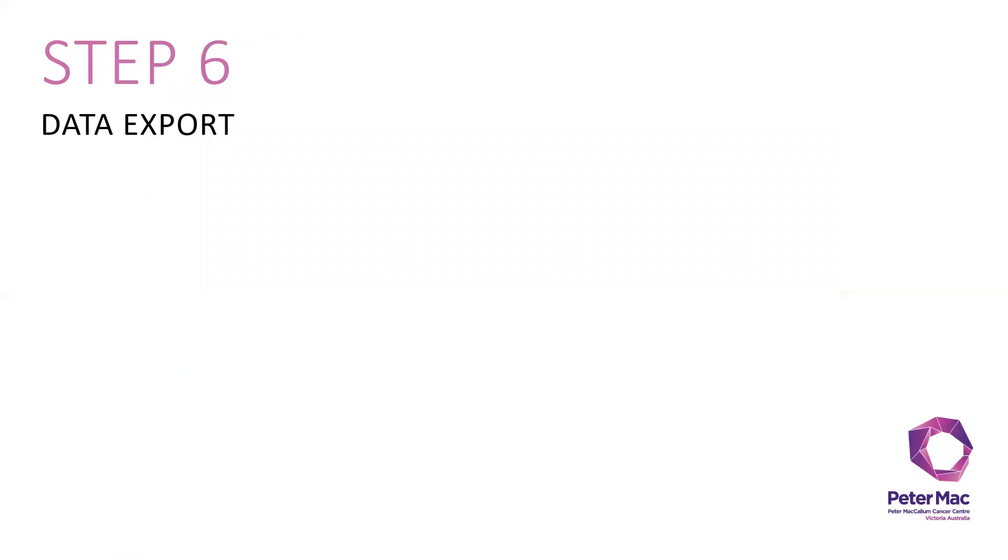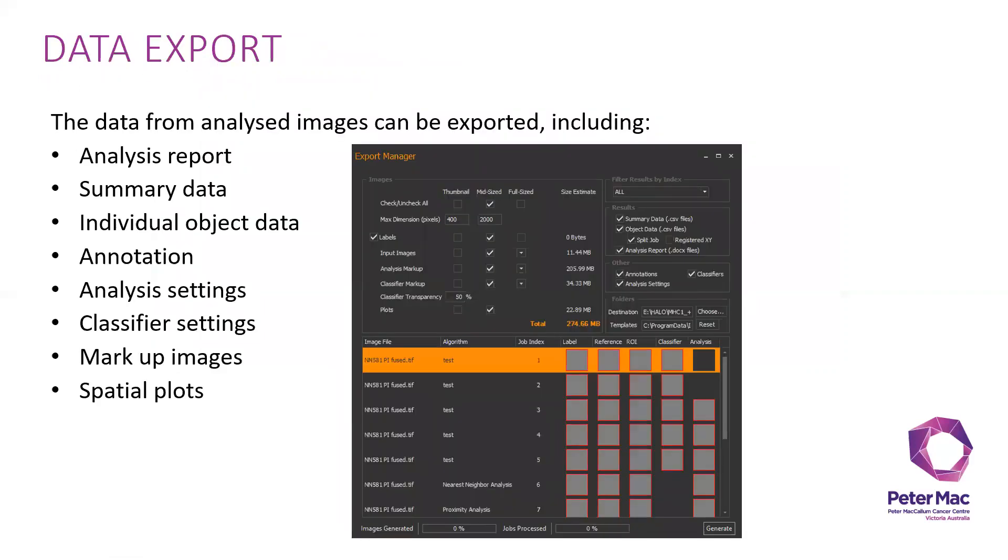Lastly, you need to export the analyzed data. The data from the analyzed image can all be exported, including the analysis report, summary data, individual object data. This is usually quite important because if you want to further use the R packages, this is where you use the data from. Annotation, analysis settings, classifier settings are usually used to be able to redo the analysis next time.